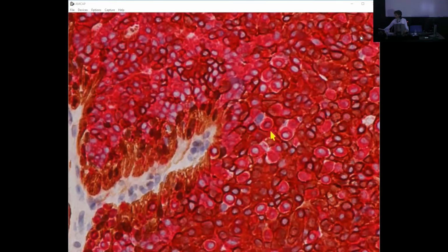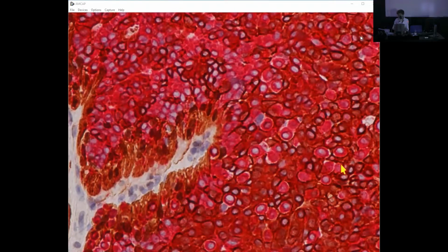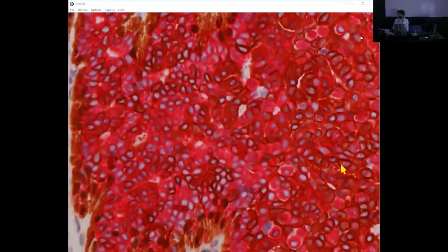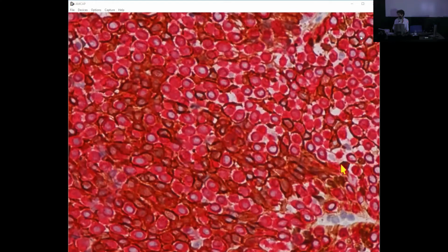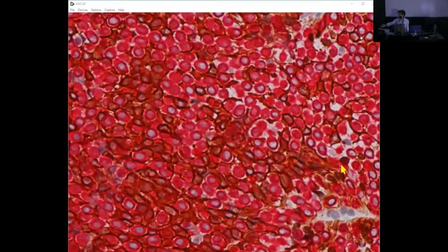And then we have our fried egg cells, which are only red. They stand out compared to the UDH cells, because the UDH is brown and the lobular cells are only red, and it actually brings out the fried egg morphology even more. So that's another stain that can be useful, especially in this area.